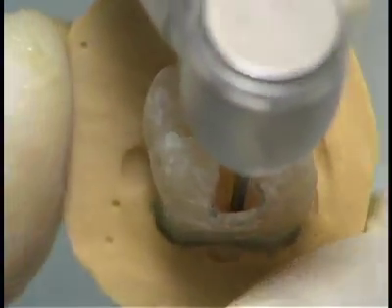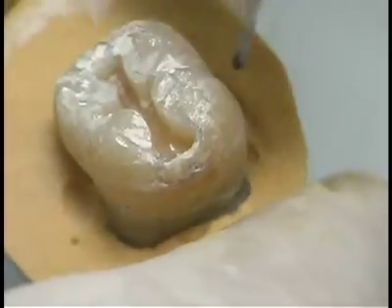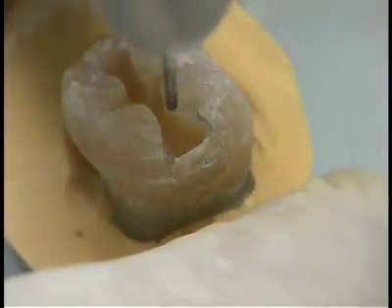Due to the morphological shape of the tooth and the contact area, the buccoproximal wall on the mandibular molar makes an acute angle with the gingival floor, and the lingual proximal wall makes a less acute angle.